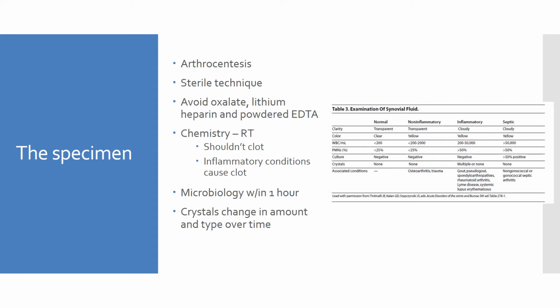Of course, ideally, we're always going to ask for a larger amount of specimen. A lot of times we ask for 5 mL because we have a 5 mL EDTA tube, so that would be lovely. But it depends on how much the patient has in the site. It will depend on how much we get.